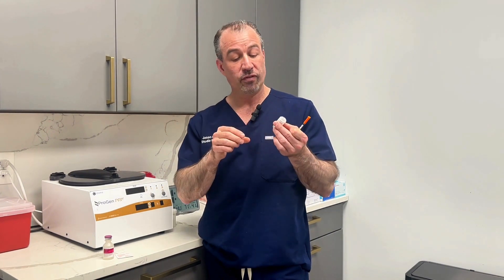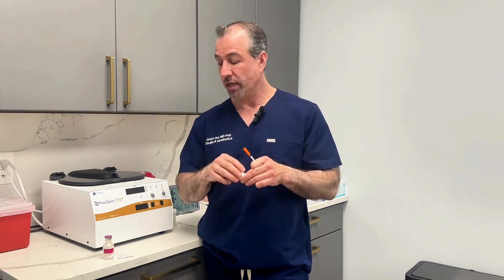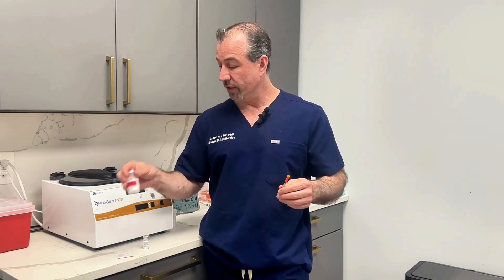It has the volume at the top — it'll say 2ml or 2ml vial. It's actually not much fluid, so when you do the injection you want to hold it upside down. For this example, I'm going to just use water for the injection.